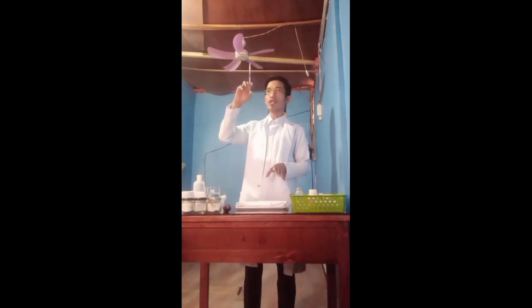So next is to keep the tip of the needle below the fluid level, just like this, to prevent aspiration of air. Allow air pressure from the vial to fill the syringe gradually with medication.